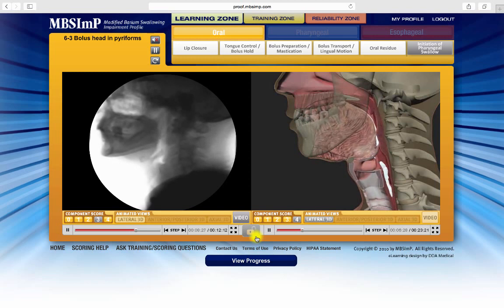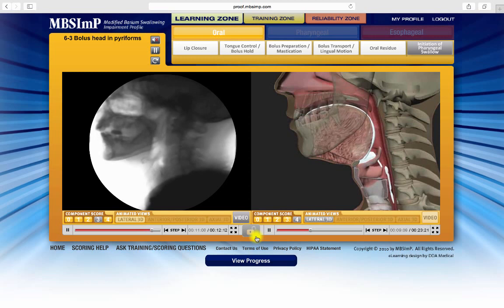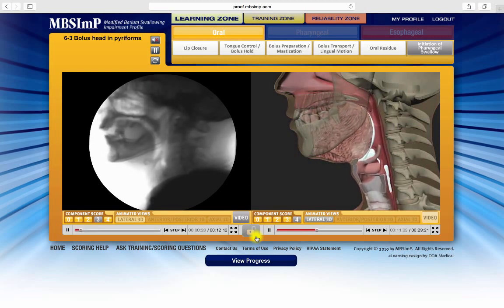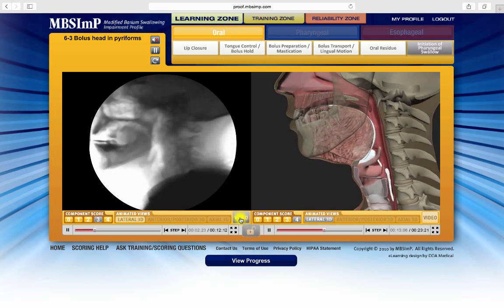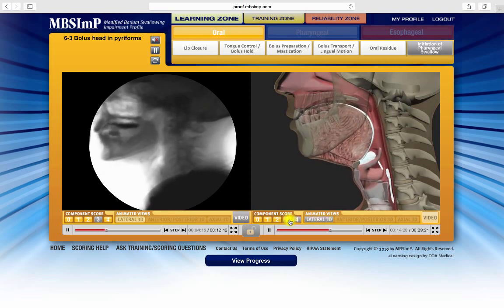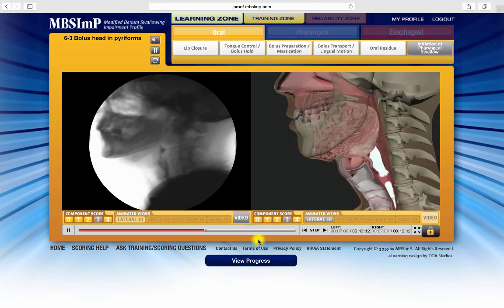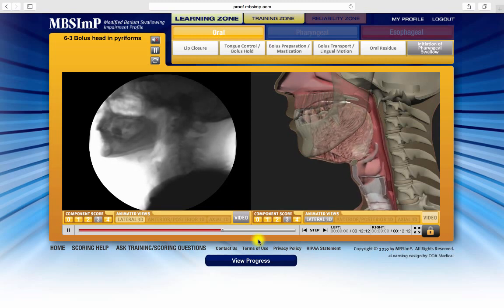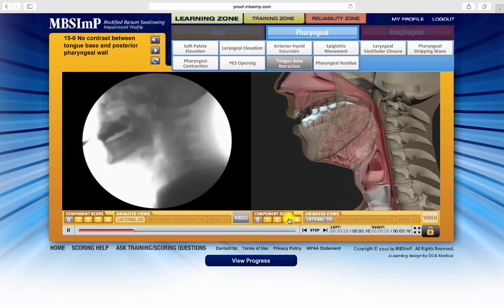However, the fluoro segment and the animation for each score of any component can be fully synchronized, enhancing the clarity of the physiology being demonstrated. First, make sure the intended fluoro and animation segments are in the desired window and each represents the same score. Clicking the lock icon will synchronize the two. While synchronized, the learning zone can still be navigated, moving among the components and selecting scores as desired.